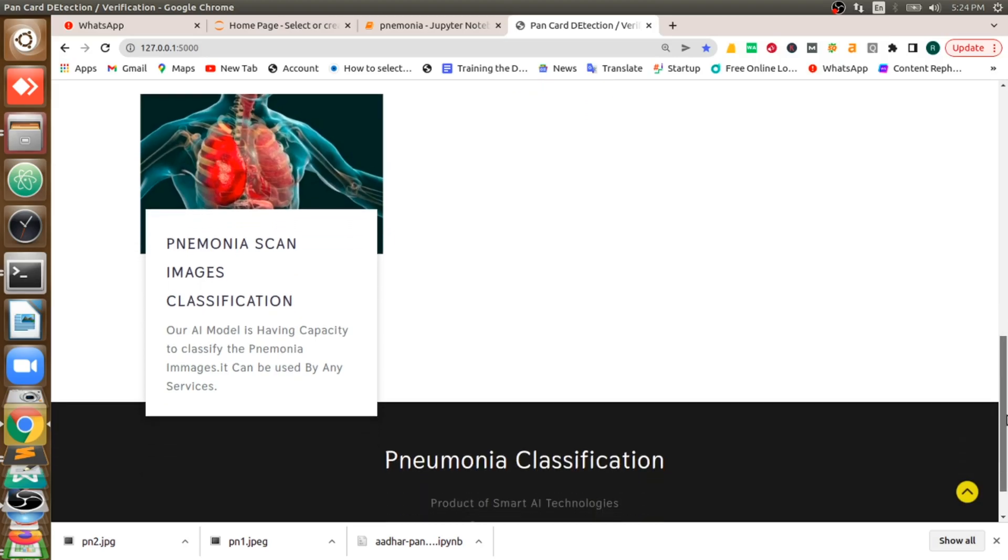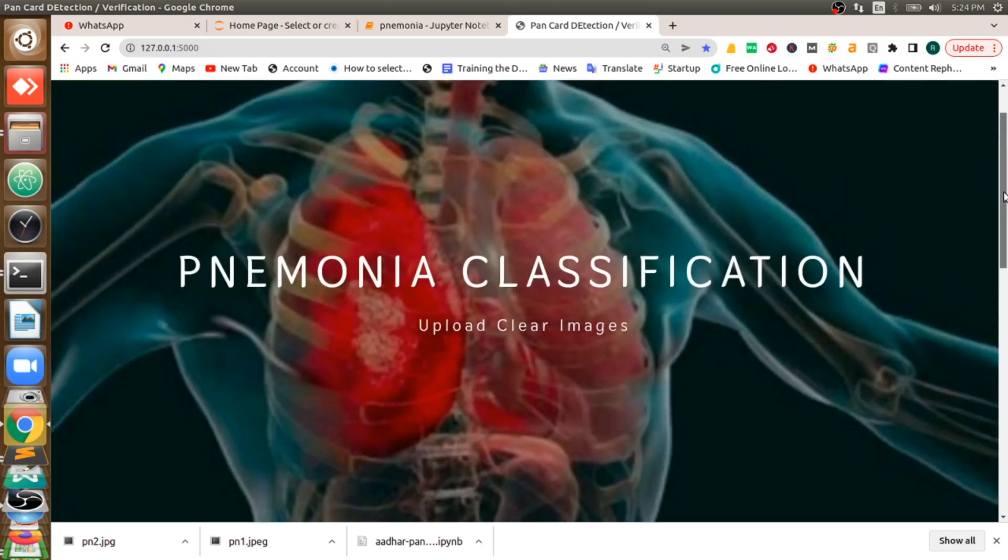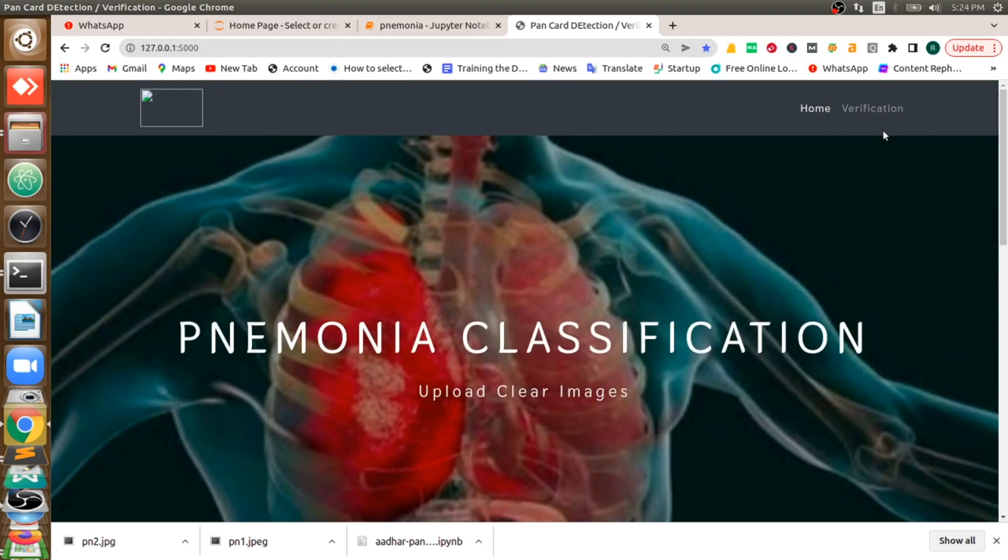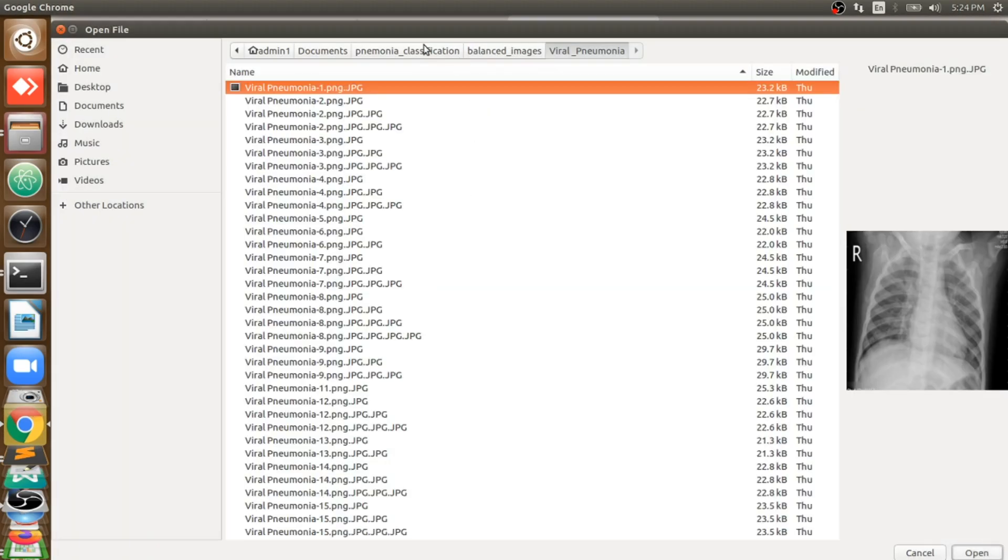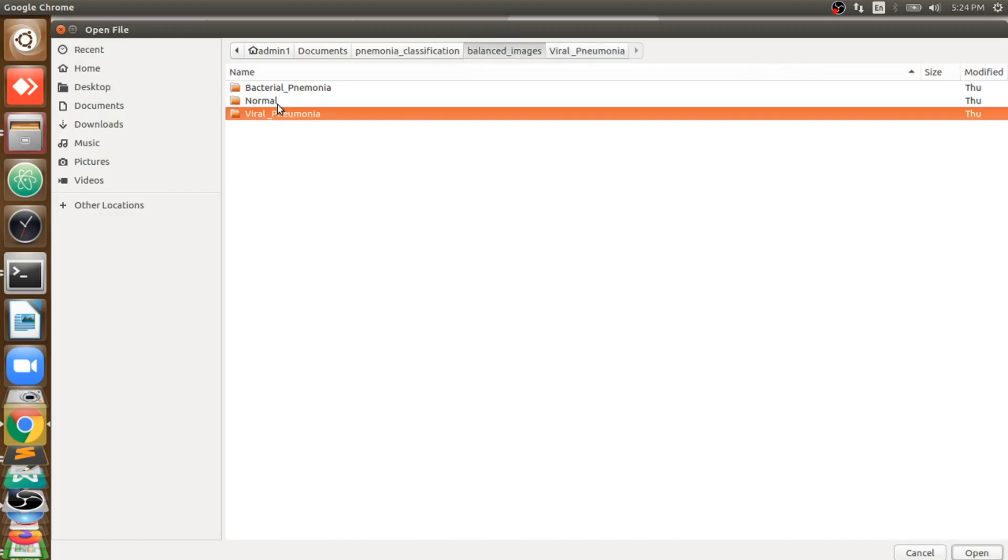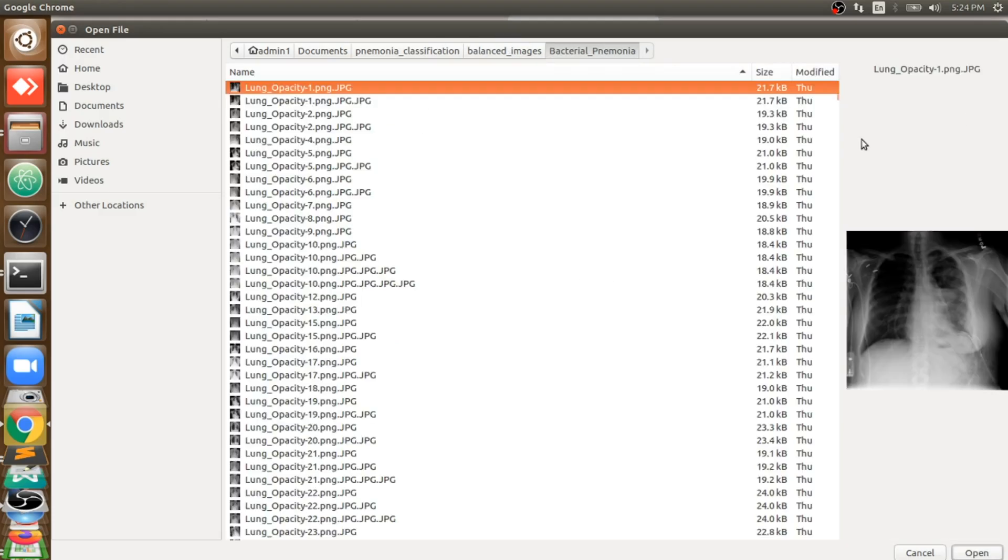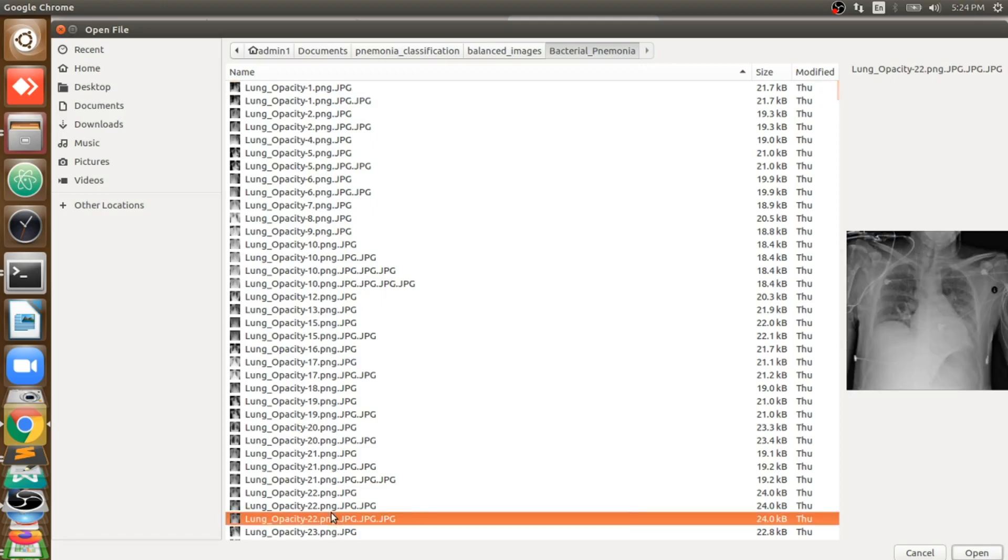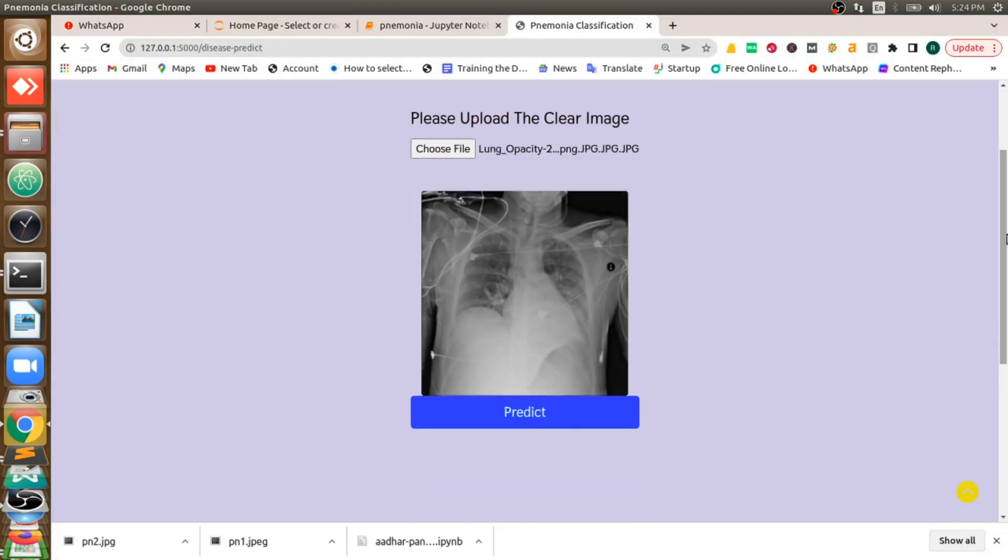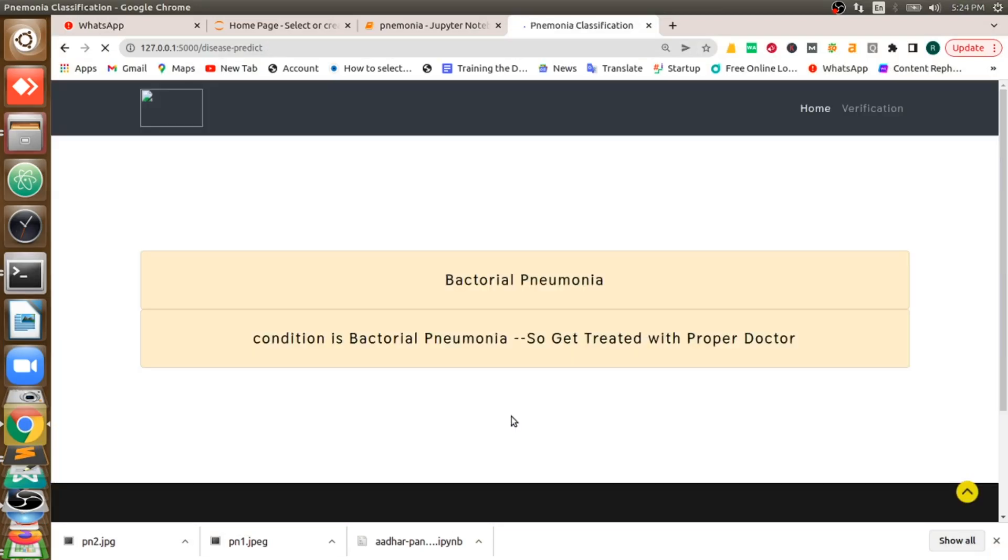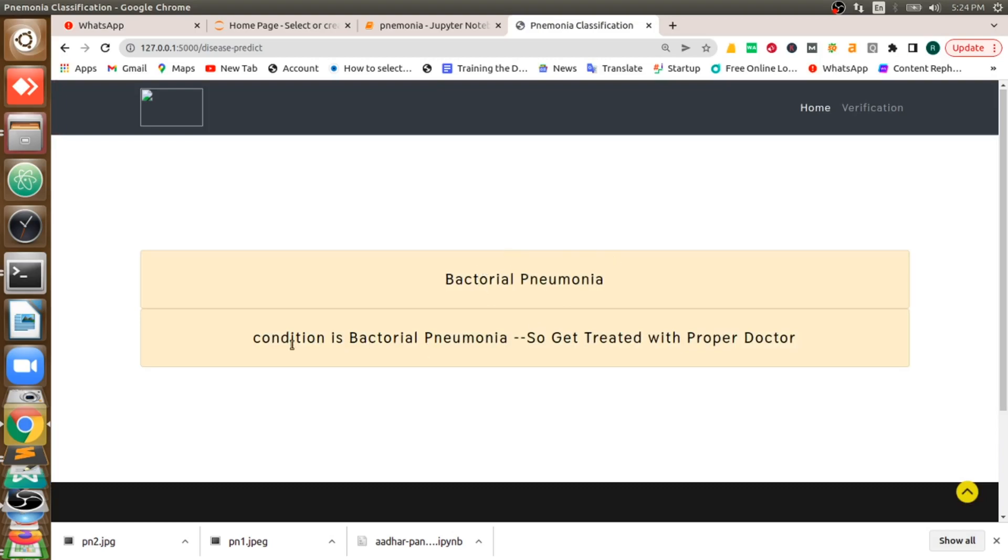Initially you can upload any pneumonia image. In this I'll upload bacterial pneumonia, some random image. And then if I ask for the prediction, I'll get bacterial pneumonia. It will give us a solution or guidance that says condition is bacterial pneumonia, so get treated with proper doctor.